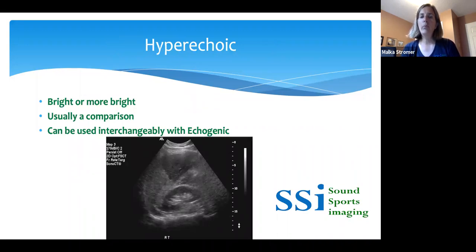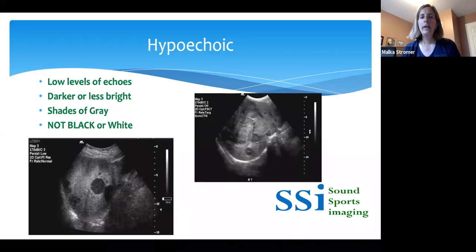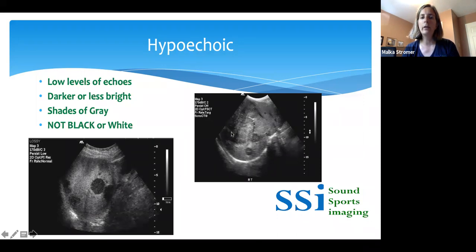Hyperechoic, as we recall, is brighter than. If we look at this image of a liver and a kidney, we can see that this area of the liver is brighter than the kidney area. So this is hyperechoic to that area. The renal sinus fat is brighter than the cortex of the kidney. There are also hypoechogenicities — darker than. We can see in two livers there are areas that are darker within the liver. Those would be considered hypoechoic to the liver.